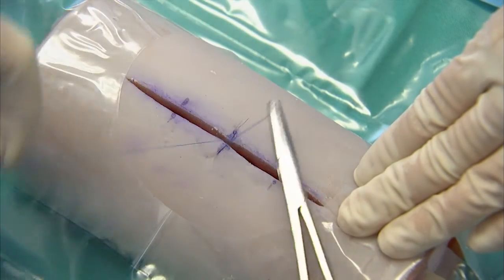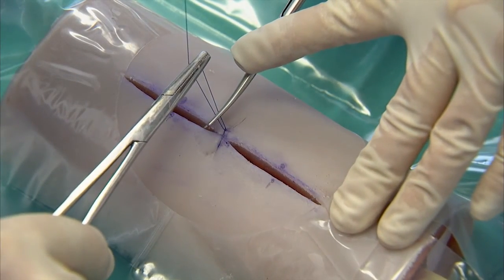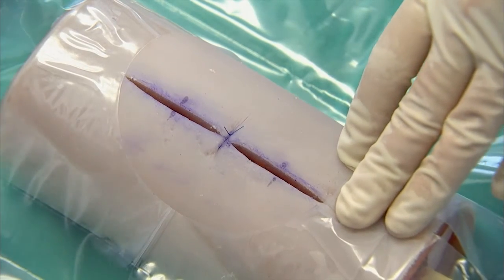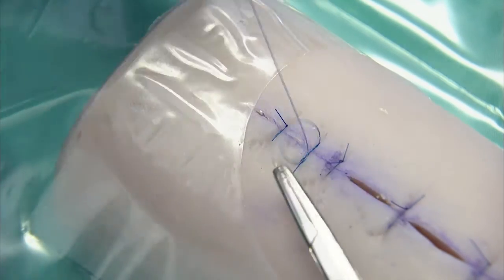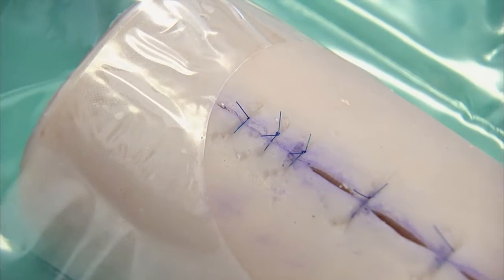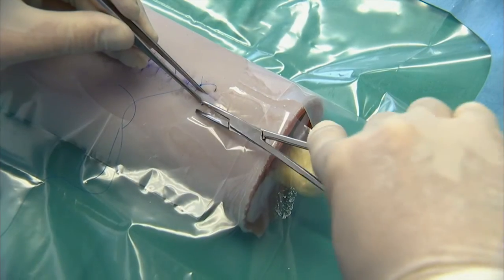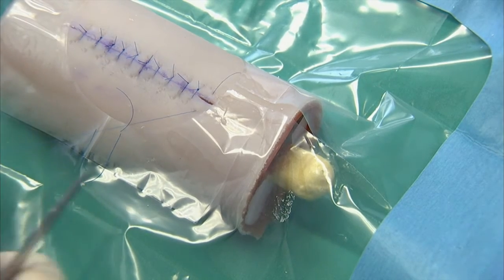The surgeon starts at the far side and enters the skin at about 90 degrees angle. The needle penetrates both the epithelium and the dermis and emerges in the wound. The course of the needle is mirrored on the near side of the wound and then eased through the skin using the needle holder and toothed forceps. Do not touch the sharp needle with your hands. Use the forceps to adjust the position of the needle.